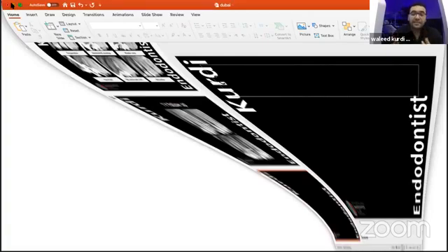If you can see the ledge under magnification, and I am saying here only if you can see the ledge, it will be very easy to remove the ledge step with the ultrasonic against the outer wall, just like a brushing motion, and you will decrease the amount of the step and it will widen the main pathway of the canal. Which type of ultrasonic is used to correct a ledge? For me, I'm always using the Ultra X if I can see the ledge under the microscope.